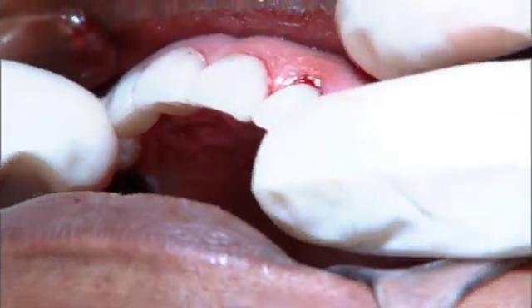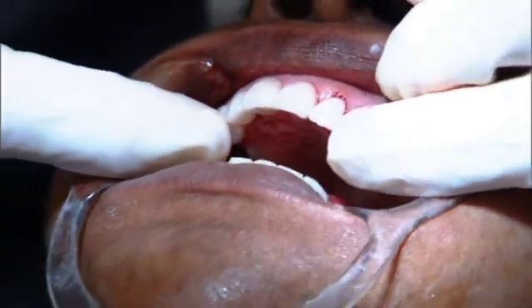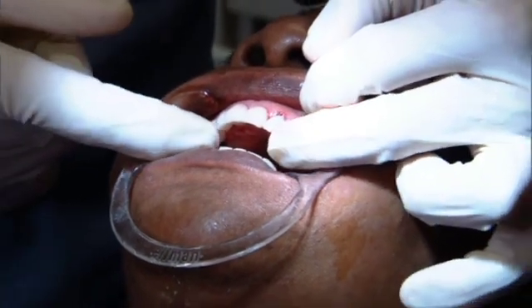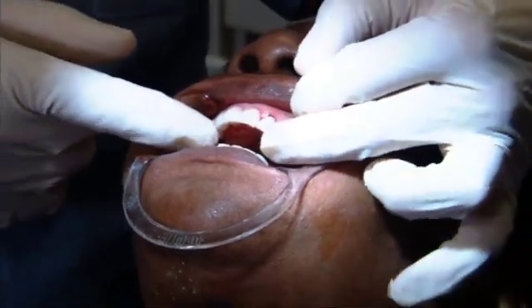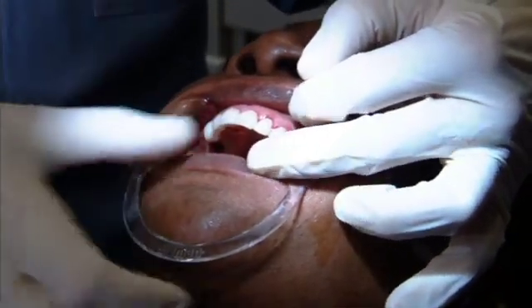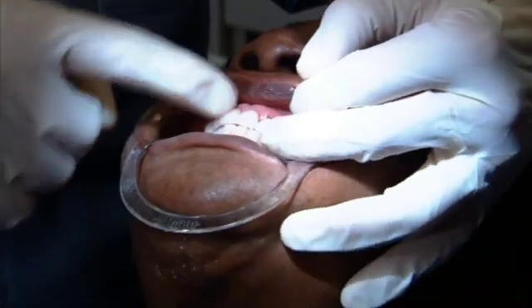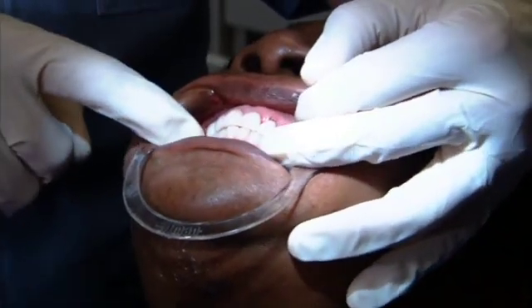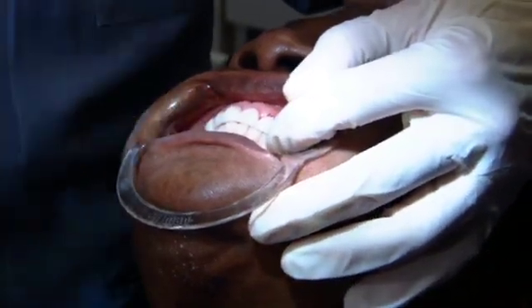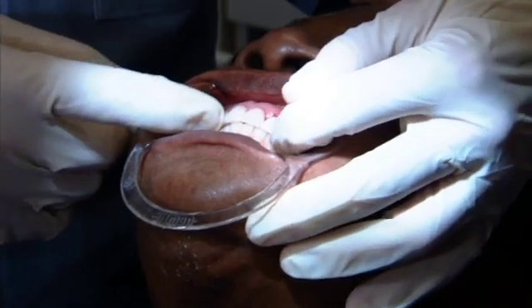acrylic. Now keep in mind that this provisional is kind of our first swing, and it's much more of just a surgical healing guide than anything else. Yet, we don't want Beverly walking around town with ugly teeth. And frankly, these are beautiful. If you look at these, let your jaw relax and close on your back teeth. If you look at these in comparison to her natural teeth, we've already got a really good idea of where we're headed shade-wise.